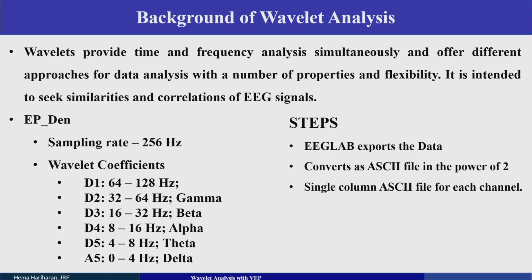Next, I'll review what this wavelet is about and how it changes the wavelet in the EEG analysis.